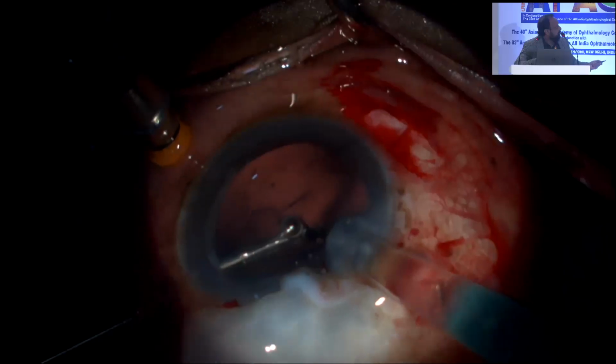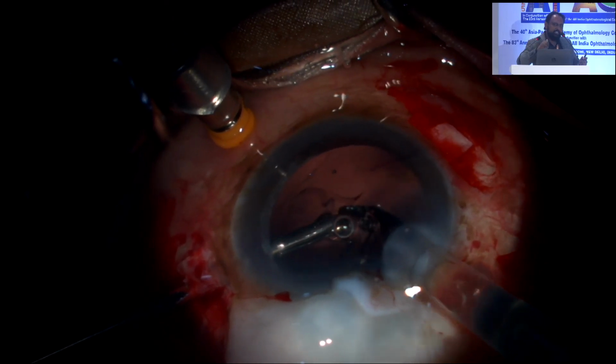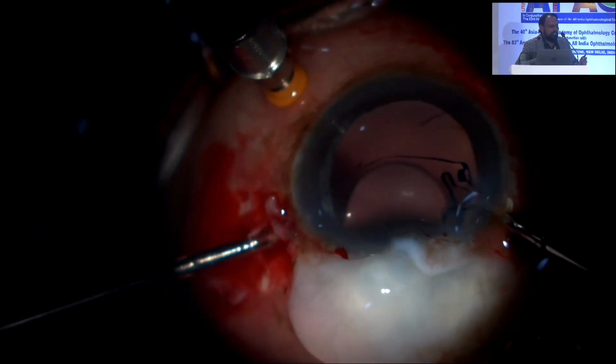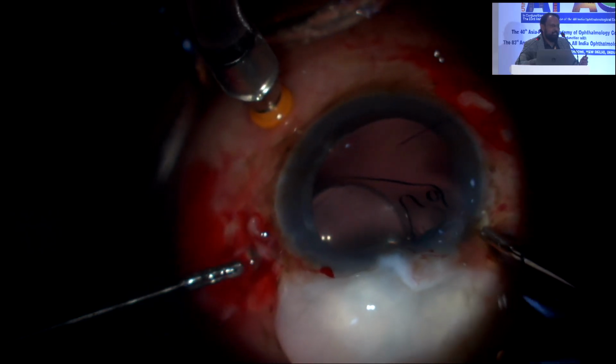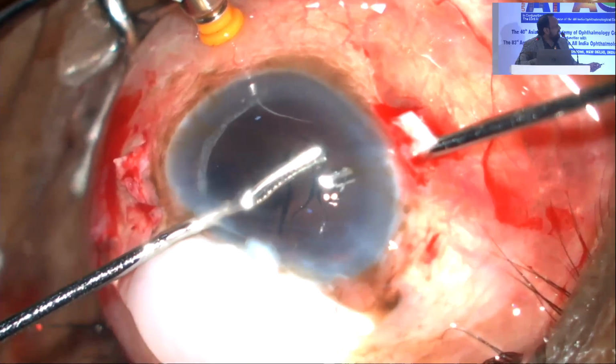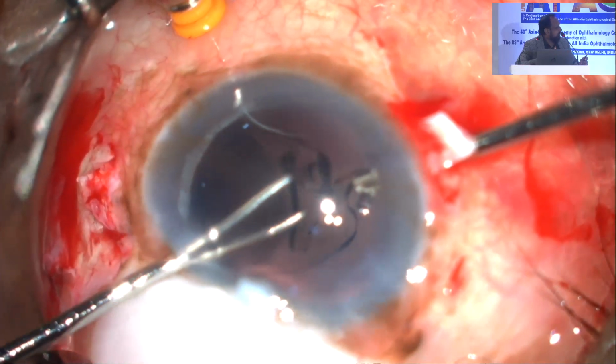As you can see, these holes, some of the surgeons have told me that they use these holes with the dialer when they want to exchange to the other hand. Some of them have been using the Hoffman's pocket to do this and deliver it, so they don't have to make the flaps. Or sometimes we also do a groove. Basically, as long as the haptic is under the sclera, it is safe and it is better.